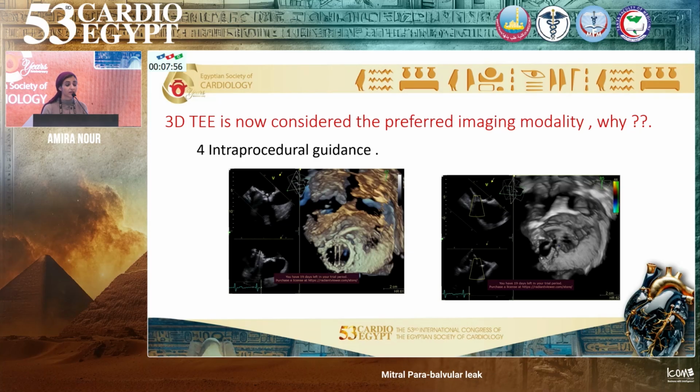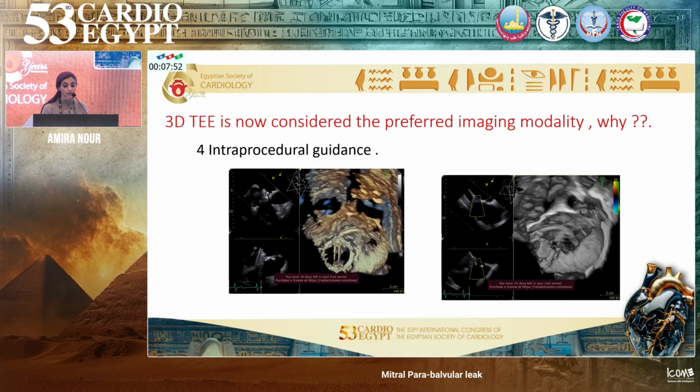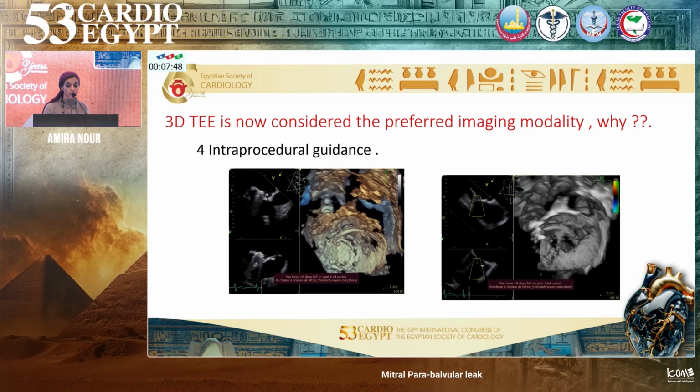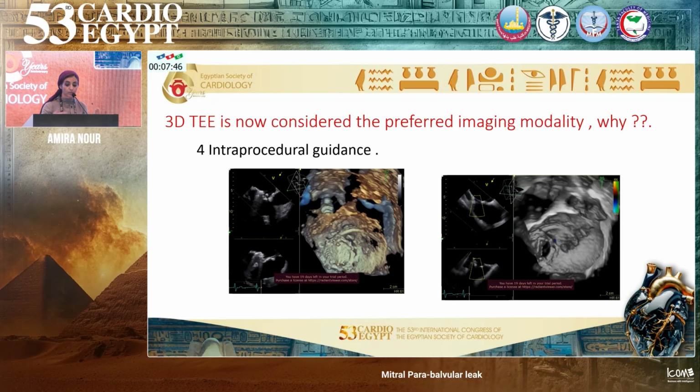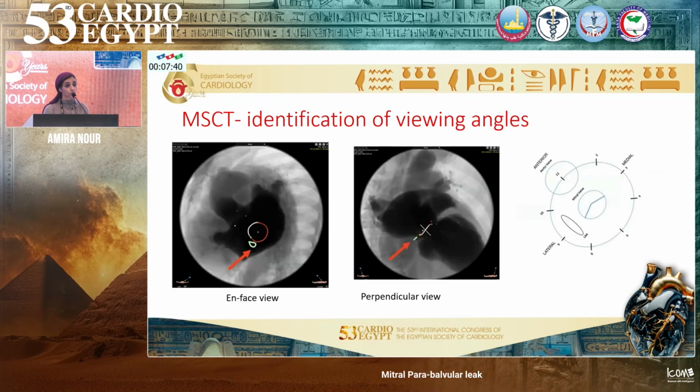However, it is difficult. And finally, it is important during the guidance of the intervention of the cardiac interventionist during the procedure, whether to move anterior, posterior, medial, or lateral, just to put your catheter above the defect in order to be able to navigate it with your wire.